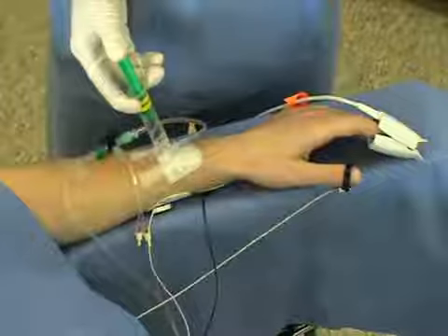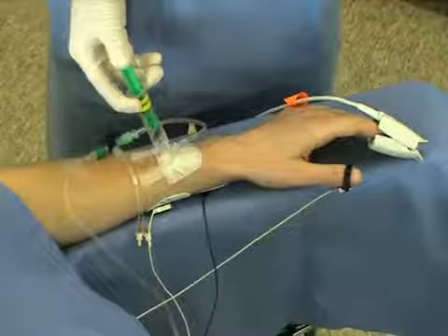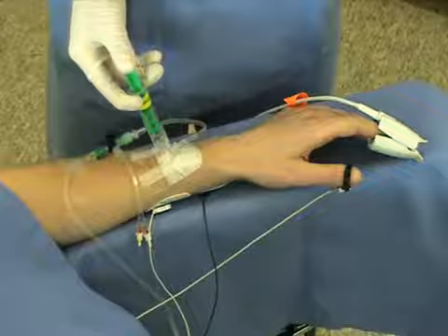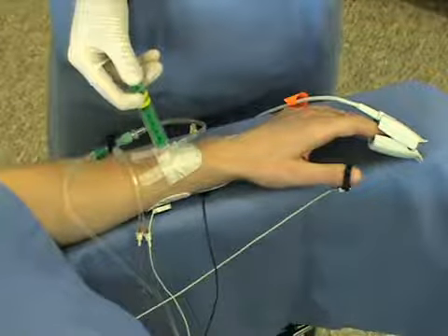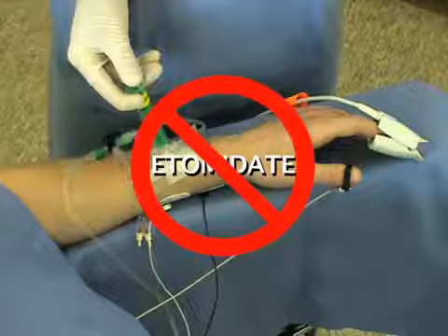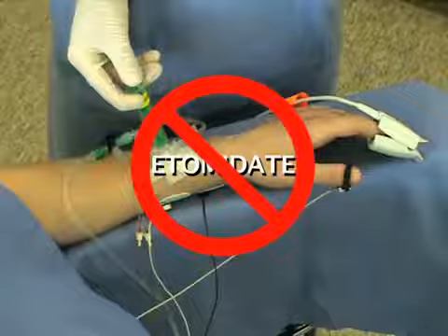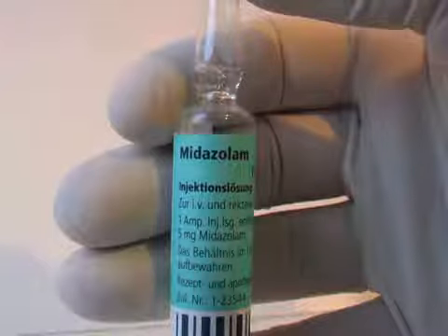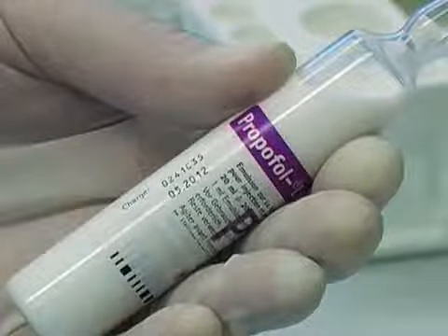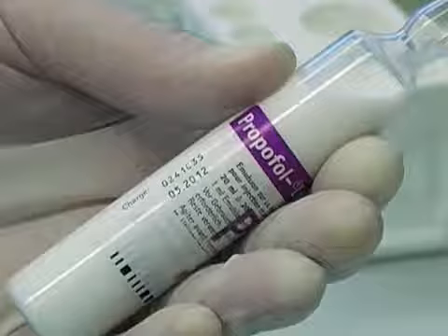To induce general anesthesia, we prefer etomidate 0.2 to 0.3 milligrams per kilogram of body weight in non-critical care settings. Note that etomidate is not the drug of choice in critically ill patients because it may induce adrenal insufficiency. Thus, another intravenous agent such as midazolam or propofol should be used in critically ill patients.